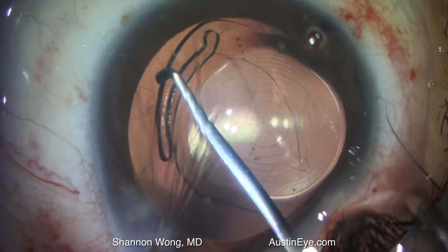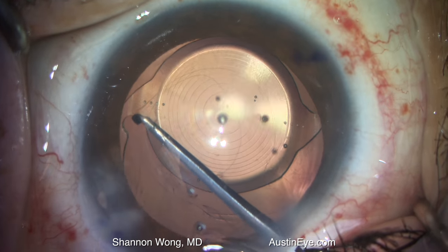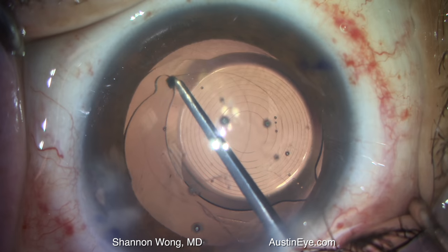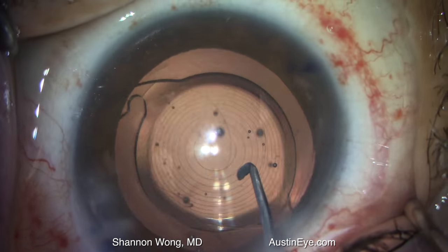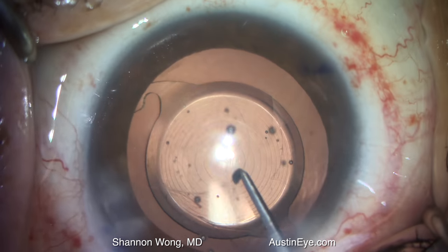For this case, we were trying to avoid using an anterior vitrectomy. We rotated the lens and everything looked almost perfect, but the lens did not quite center exactly as we wanted it to look after surgery. Therefore, we elected to use an anterior vitrector.